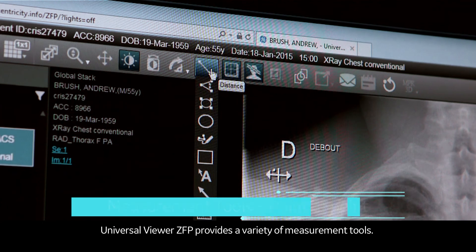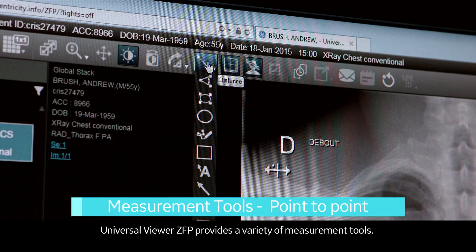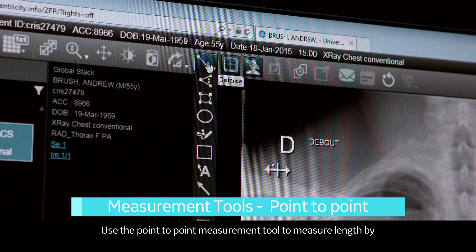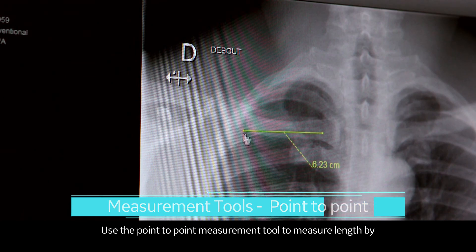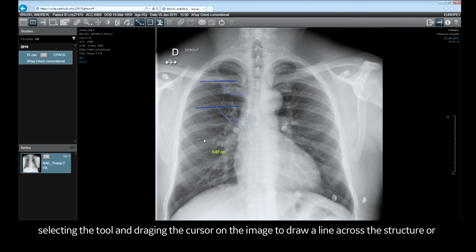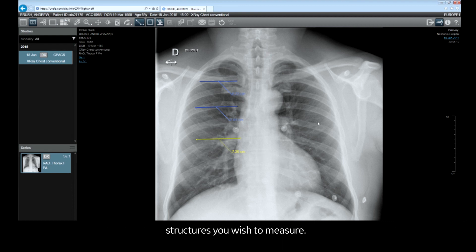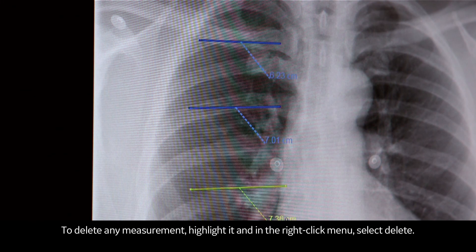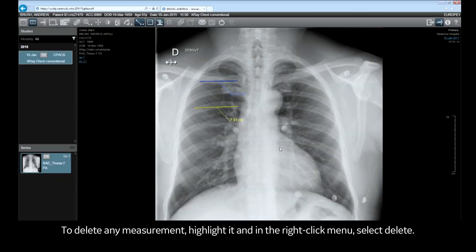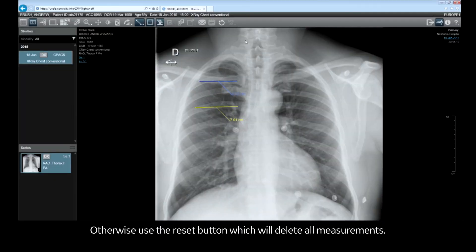Universal Viewer ZFP provides a variety of measurement tools. Use the point-to-point measurement tool to measure length by selecting the tool and dragging the cursor on the image to draw a line across the structure or structures you wish to measure. To delete a measurement, highlight it and in the right-click menu select delete. Otherwise, use the reset button which will delete all measurements.